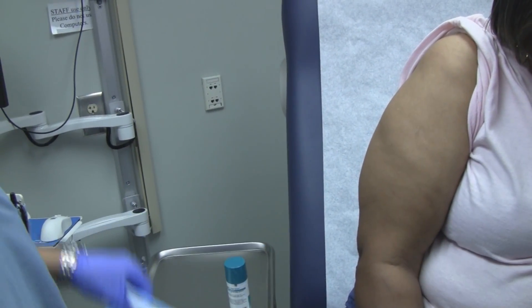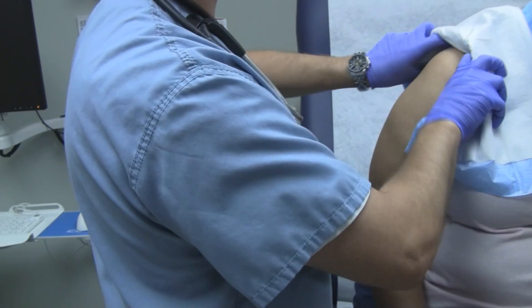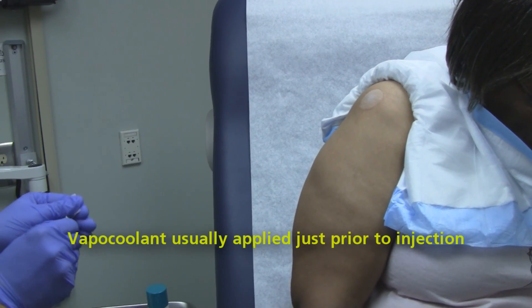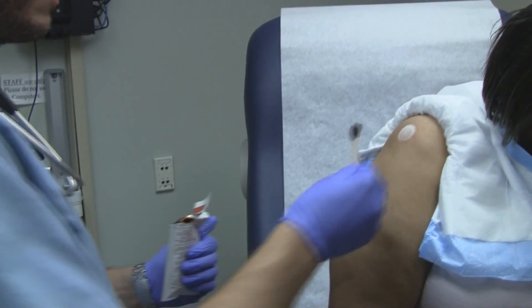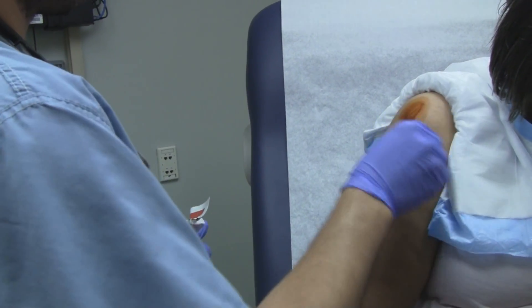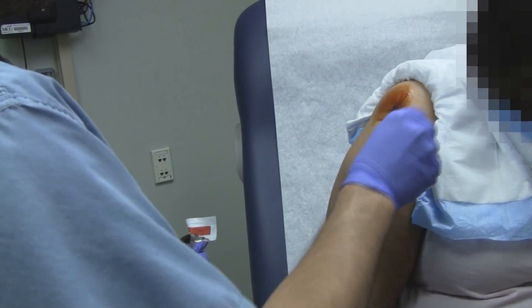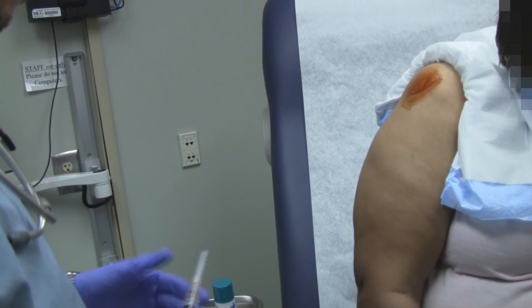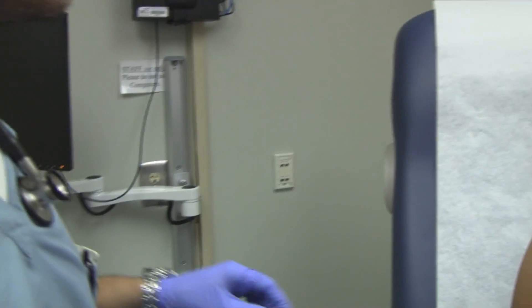It's going to be a little bit of stick and burn. Since we're going into the subacromial space and possibly can get into the joint up here, we're going to use some iodine swabs. We've already marked the area. We drew up two cc's of half percent Marcaine and 40 milligrams of solumedrol, so that's what we're going to use to inject.